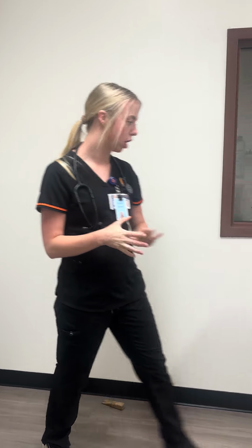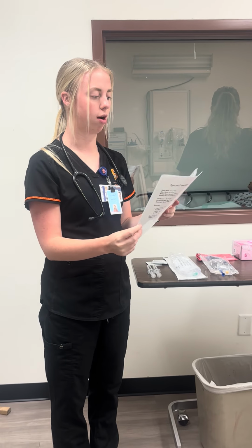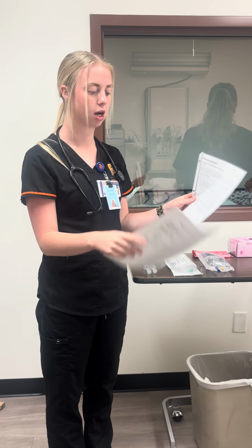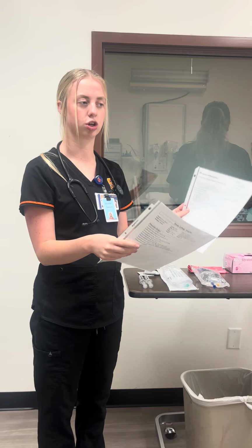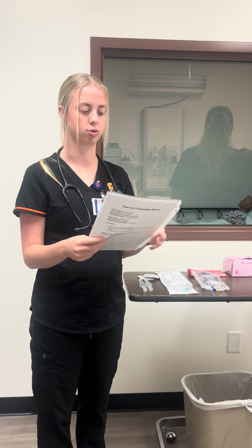Okay, today I'm going to be doing a blood transfusion on a patient. So I would start out of the room by making sure I have my orders from the doctor that we need this blood transfusion and why we're administering it, along with the type and cross-match result, making sure that we've checked the blood. I will take this into the room as well to confidently ensure this with my patient.